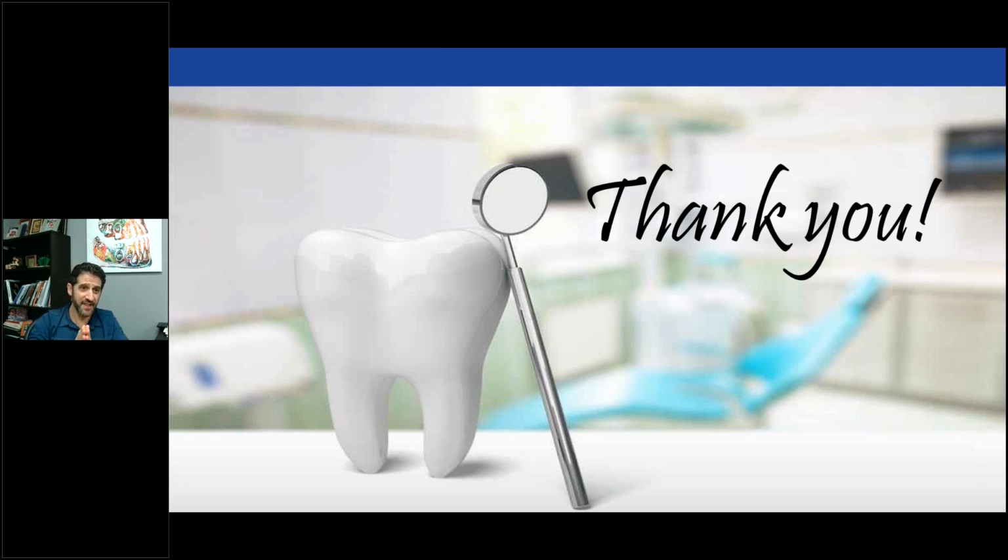And because it has that beautiful gradient, I suggest doing it, by the way, with an A3, so you can really see the transition in colors from the gingival area to the incisal area. That will really give you the nice transition of colors. You can see the difference in them before you even glaze them. And then you can choose either to use 2 of those programs, 3 of those programs, maybe work with 4 programs. So it's changing the oven 5 to 10 degrees to get different results. It depends how detailed you want to get.